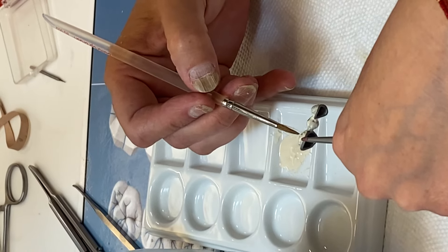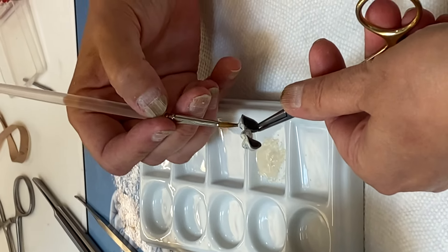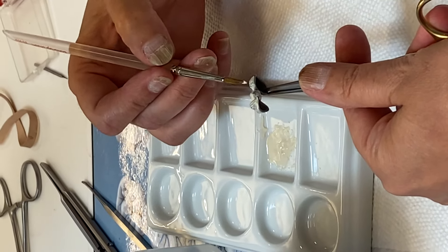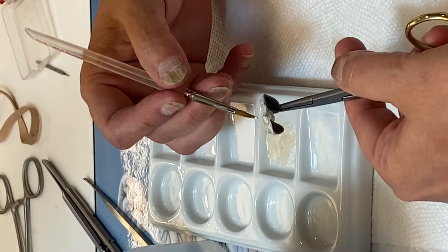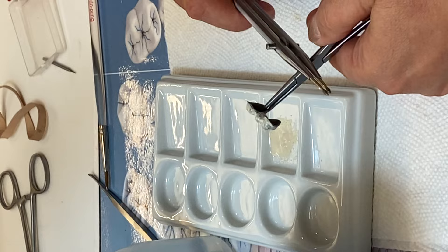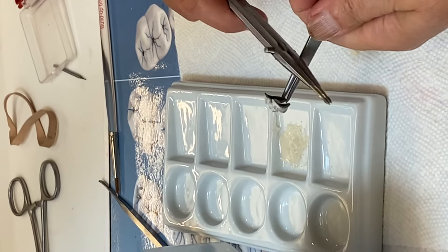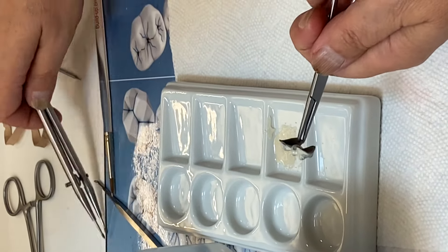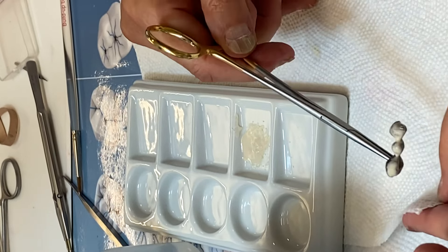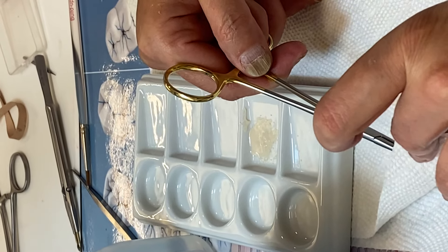Another trick to ensure that your opaque layer is even and also to get rid of the excess moisture in the porcelain is to vibrate. So we're going to vibrate the framework a little bit, and you see how the porcelain kind of evens out. And with a tissue, very gently, we're going to go ahead and take out the excess.